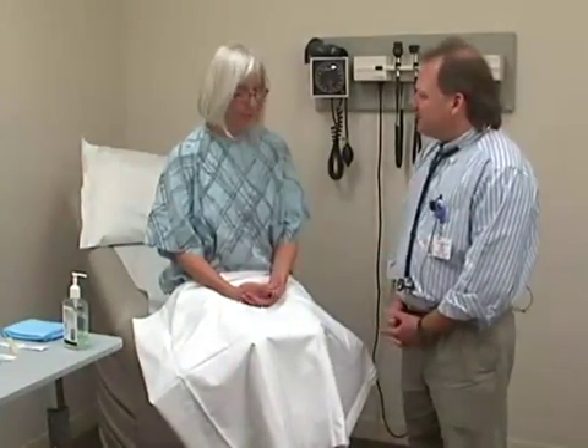Mary here has agreed to be our patient. Good morning Mary, would it be okay if we practice and demonstrate a physical examination on you this morning? Thank you. So the first step is going to be making sure that everything is comfortable and appropriate privacy has been maintained.